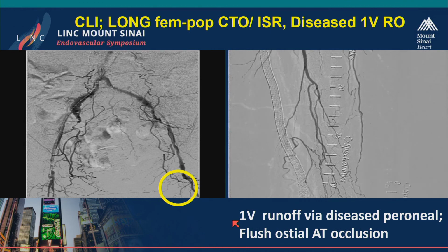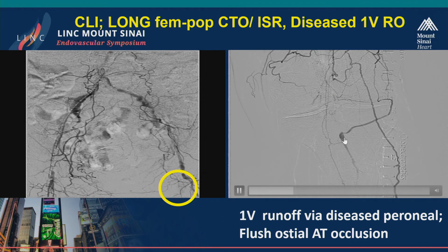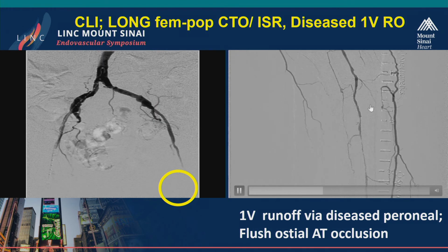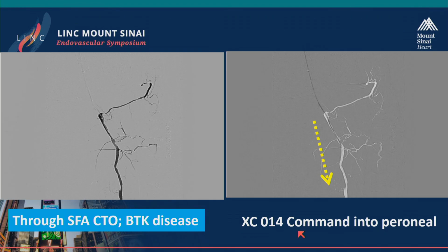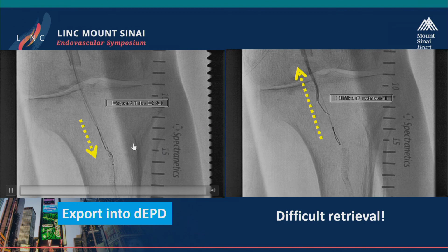So let's highlight that with some cases. Here's somebody with CLI. They had one vessel runoff, and it was via a diseased peroneal down here. That's all they had. They had an anterior tibial, but they had a lot of occlusions in the past. So we were able to get through that long occlusion of the stents before and stay in the lumen and get a wire into that peroneal. And our plan was to clean it out. Here was a jet stream, and then do definitive therapy with DCBs.